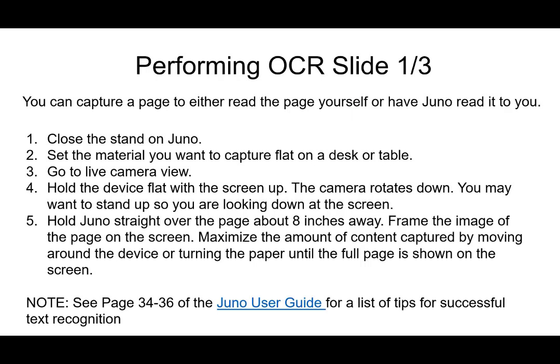Performing OCR is pretty simple. You can capture a page to either read it yourself or have Juno read it to you. The first thing you need to do is close the stand on the Juno, then set the material you want to capture on a flat surface like a desk or table. Make sure you're in the live camera view and hold the device flat with the screen facing up. The camera will rotate down to face the document you're trying to capture.